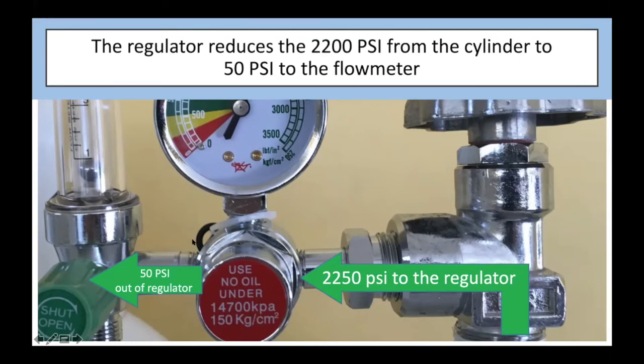You can see on these green arrows that one says 2,250. That actually is the maximum that you will see sometimes coming from cylinders. Generally, we talk about 2,200, but it could be 2,250. In either case, the regulators are preset so that the pressure that comes out and goes to the flow meter is at 50 PSI.